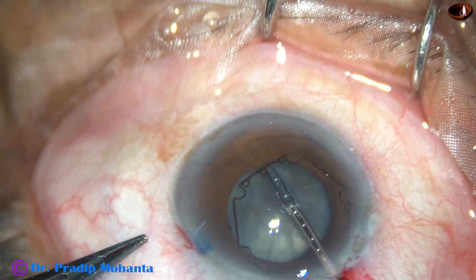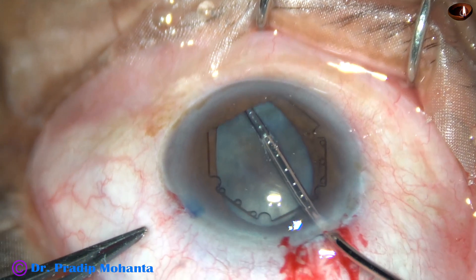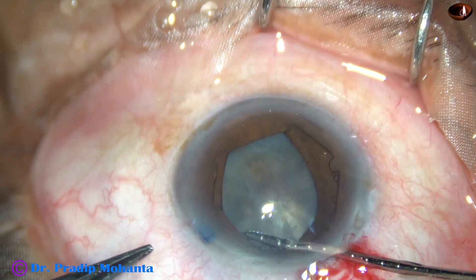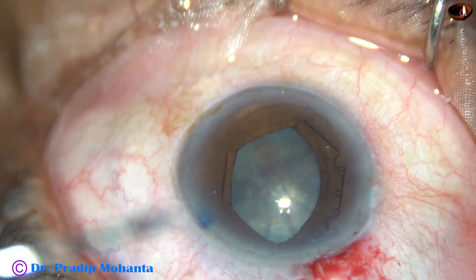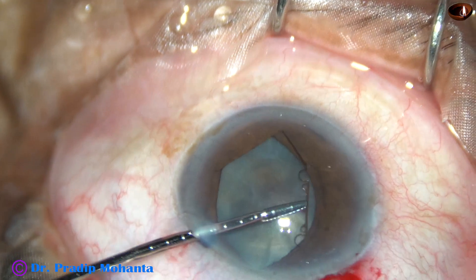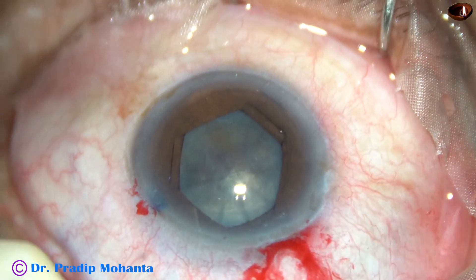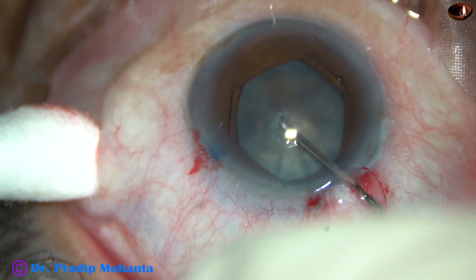I tuck the flanges with the tabs. I hold the middle tab and tuck the leading flange, and the device goes into the anterior chamber completely. Through the main incision itself, I can tuck the flange on the left side near the main incision — the flange centered at around one o'clock. And through the left side port, with the left hand, I can tuck the other flange which is centered at ten o'clock.